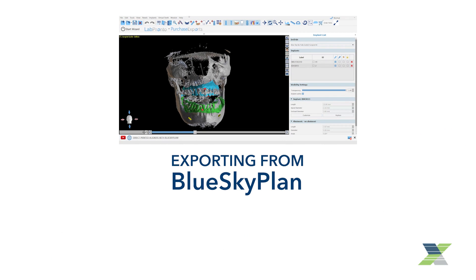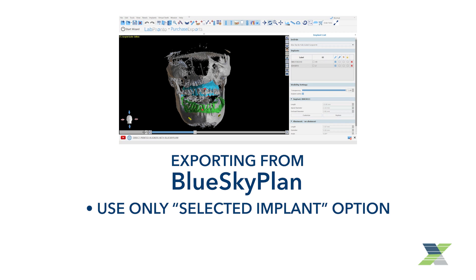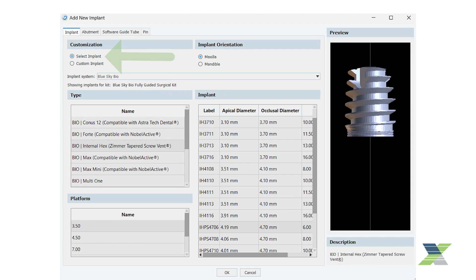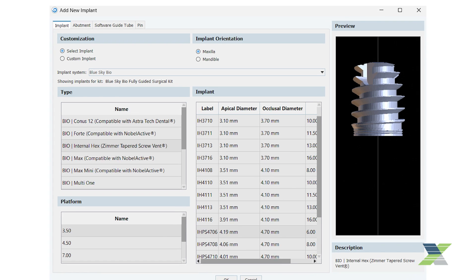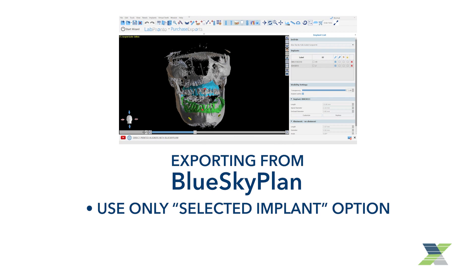It's important to note that if exporting the Blue Sky Plan for use in XGUIDE, you must utilize only the Blue Sky Plan selected implant option in the implant library. Custom implants do not export in the XGUIDE proprietary format.